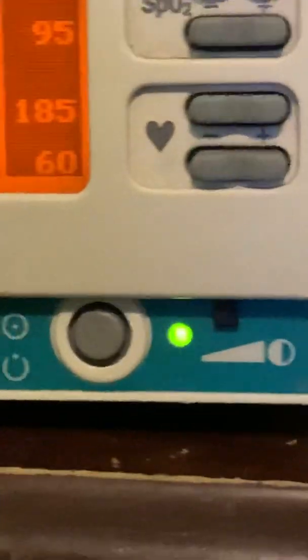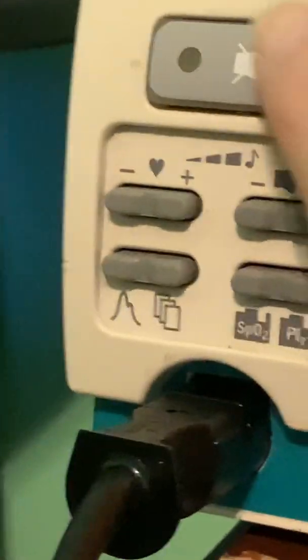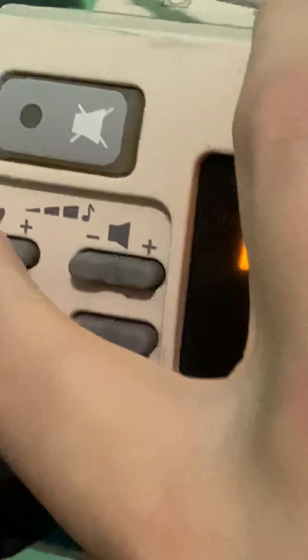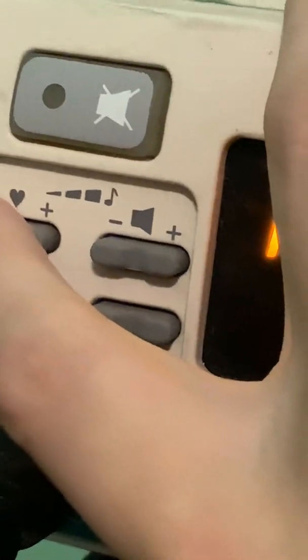It goes up to five settings. It beeps to my pulse and changes pitch according to my oxygen saturation. I'm going to turn that down to one — actually, let's put it on two.